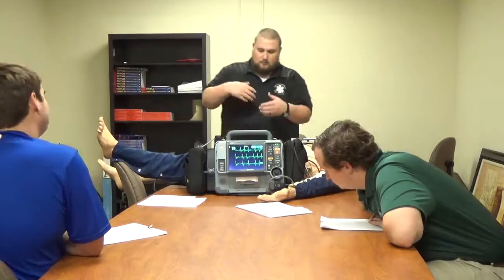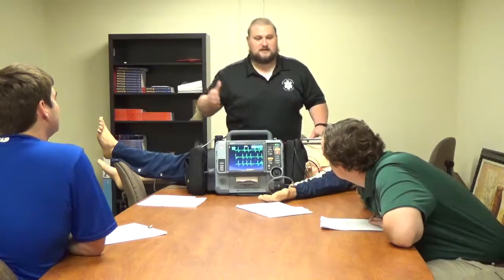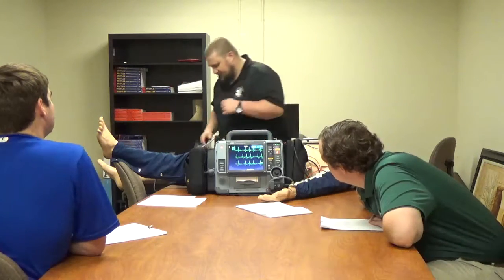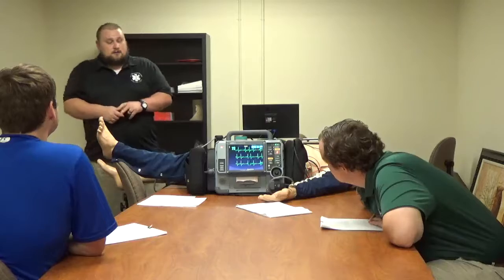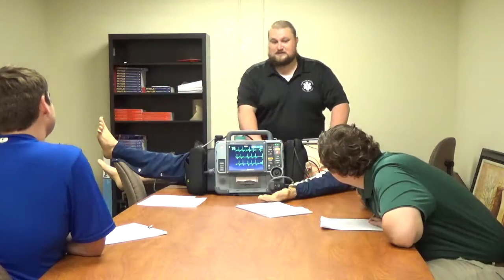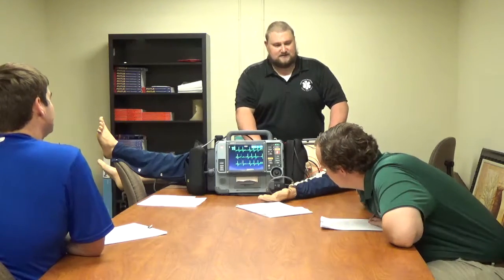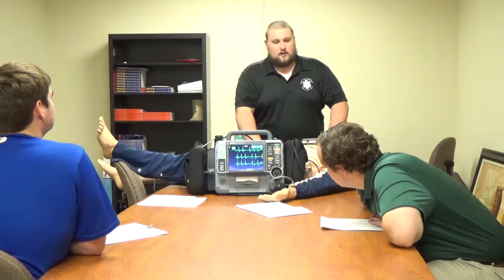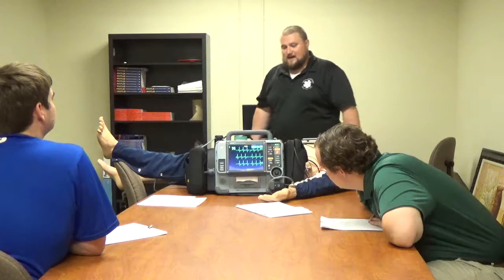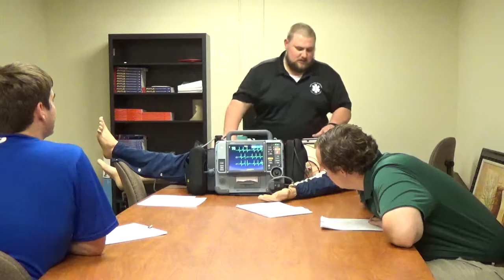Okay? And you don't really need to get wrapped up in your conduction ratios on that, because a second degree type 1 is a second degree type 1, no matter what the conduction ratio is. The treatment for second degree type 1 is usually to monitor the patient unless we're showing signs and symptoms of hypoperfusion, more than likely secondary to a bradycardic reason. We're just going to follow our normal bradycardia algorithm on this. These patients are going to get some atropine IVP at 0.5 up to a 3 milligram max dose, but you're going to give it in 0.5 milligram increments.